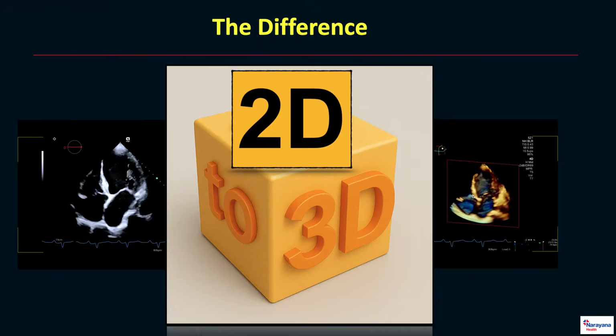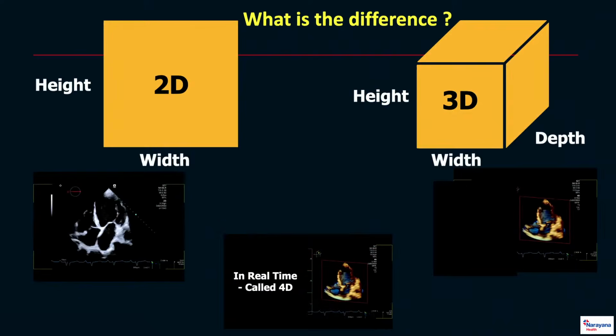So you see the top one in black and white and the one below, so you have a dramatic difference between the two of them. You have a 2D image on one side and a 3D image on the other, and they look entirely different. It's always the 3D which is aesthetically what you want to see, and then it has its own pluses and minuses.